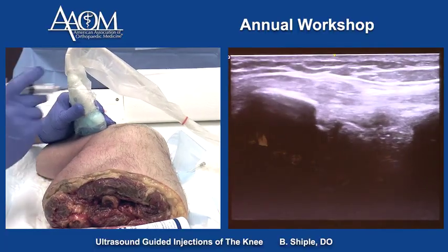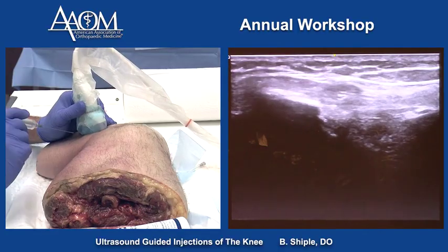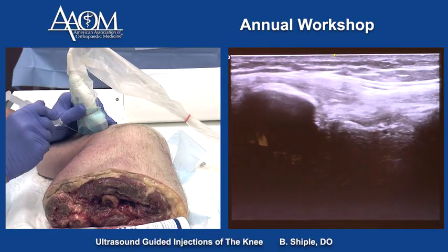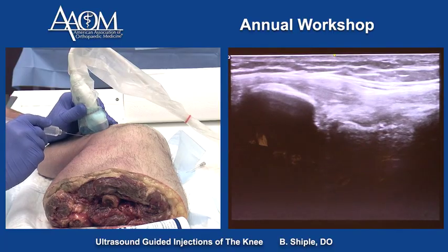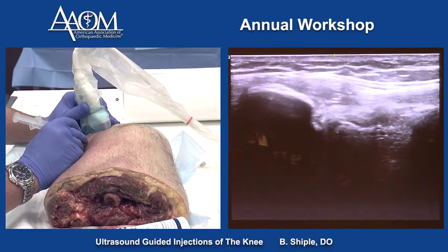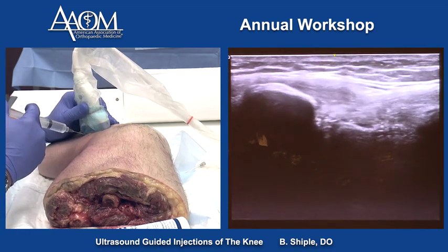If we wanted to get into the proximal tib-fib joint, it's right in the middle of the screen. We can access it in short axis for an unstable tib-fib joint, and I'm in the joint right there. We can put a little fluid in there.